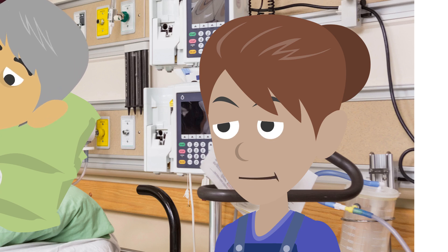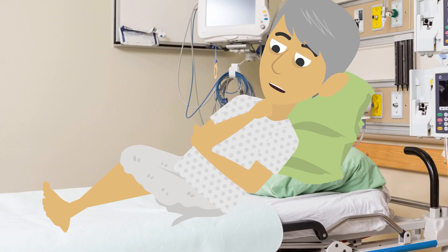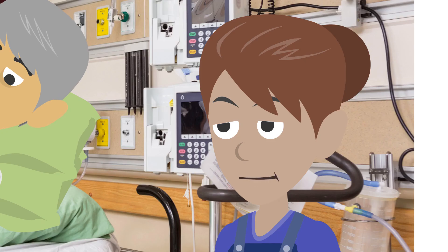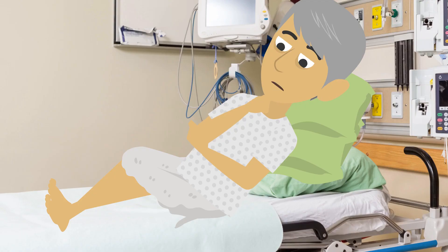Okay, before I put in the tube I need to check that your nose is clear. Can you please sniff with one nostril closed for me and then repeat with the other side? Sure. That's great. I'm just going to lubricate the end of the tube with some warm water to help the tube go in more easily. I'll put the vomit bowl next to you so you can reach it easily in case you need it. I've also checked that the oxygen next to your bed is working as well as the bedside suction.